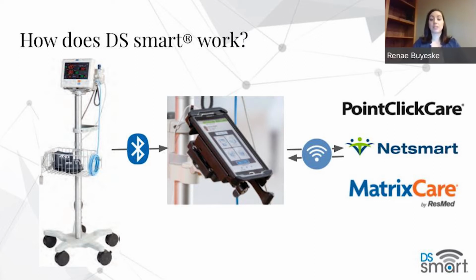Like we said in the beginning, DS Smart is an app-based platform. That app is downloaded on a tablet that you see in the picture here and allows us to run the platform and grab that information from the vitals equipment. What's associated with this bucket is 1, a tablet, so to be able to run that app-based solution and see the platform working on that tablet and going through and doing your rounds.